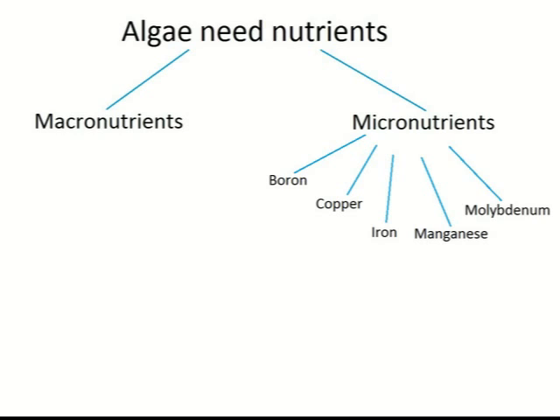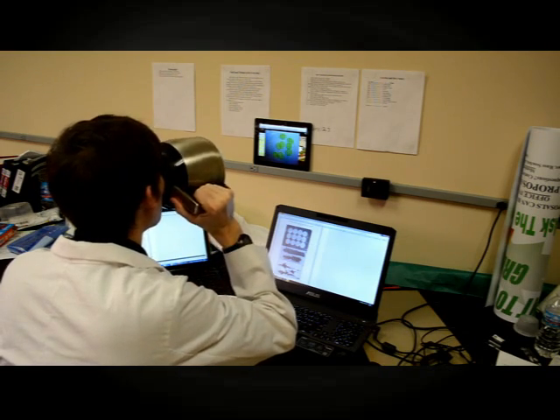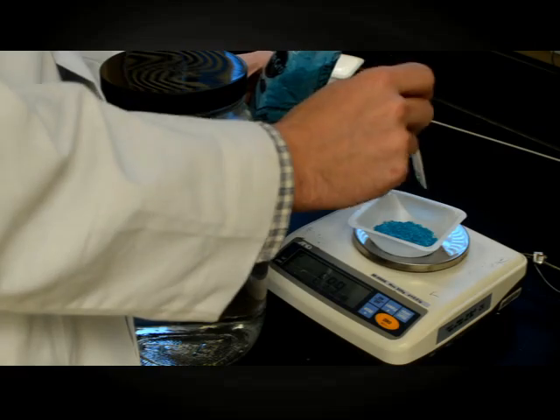iron, manganese, molybdenum, and zinc, all needed in small amounts for the algae's diet. It is important to research your algae's needs before starting to grow them, so let's get started with putting your algae in a Miracle-Gro medium.